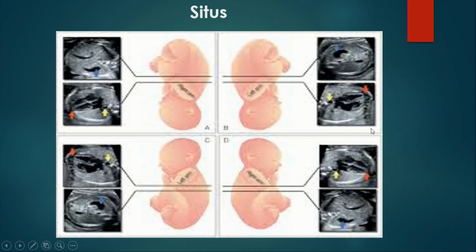To start with, most important is to know the situs of the fetus, that is the right or left side of the fetus. There are many methods to know the right and left side of the fetus. You may keep a doll over the maternal abdomen according to the fetal position and identify the situs. But keeping a doll in ultrasound may be controversial. Second, you may assume yourself in the womb according to the fetal position and identify the right and left side of the fetus.